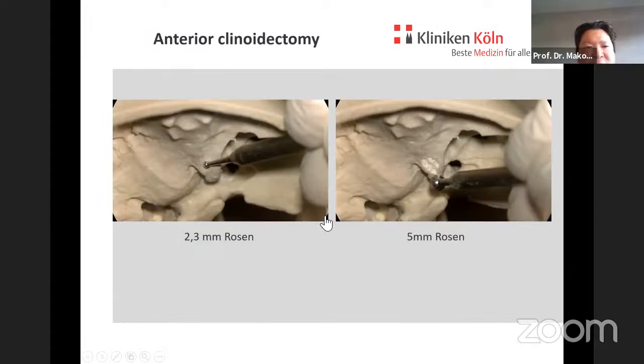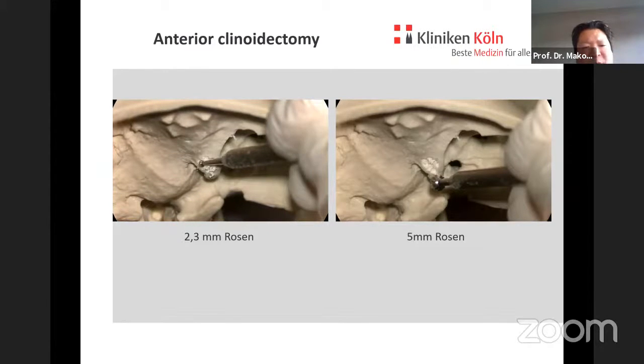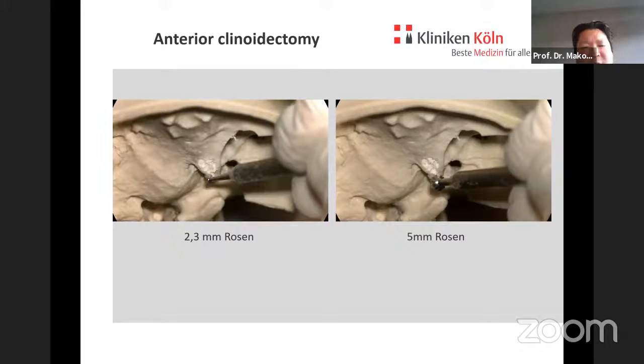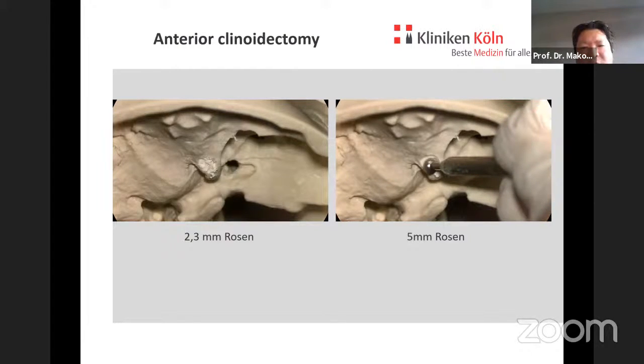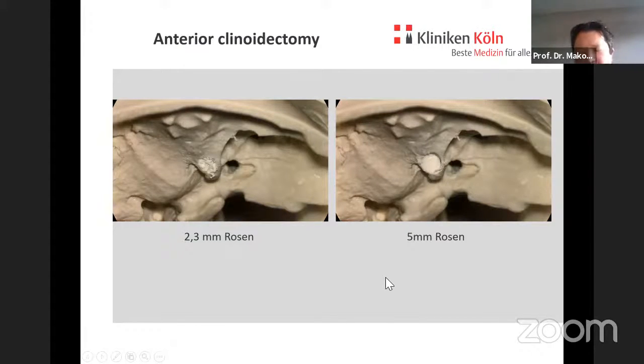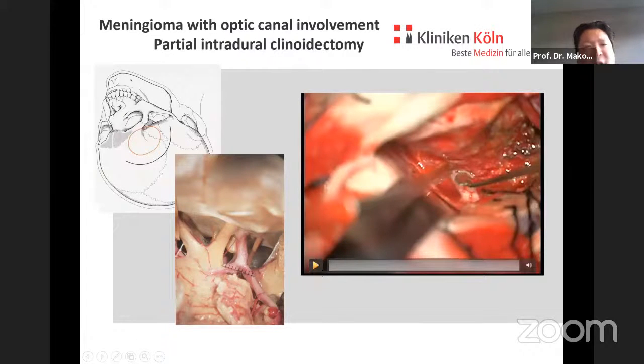So also for anterior clinoidectomy, the same holds, that one should not begin with the smallest burr. When you begin with the 2.3 Rosen burr, this is the ACP, you just drill small holes, and it's really dangerous when you suddenly have a small hole which directs to the optic nerve. So in these cases, it's much better to begin with a larger one. Of course, the Rosen burr is limited, so you switch quite quickly to the diamond burr. And with the diamond burr, you're much safer. It takes a little bit more time, but the first step is much better done with a larger burr.